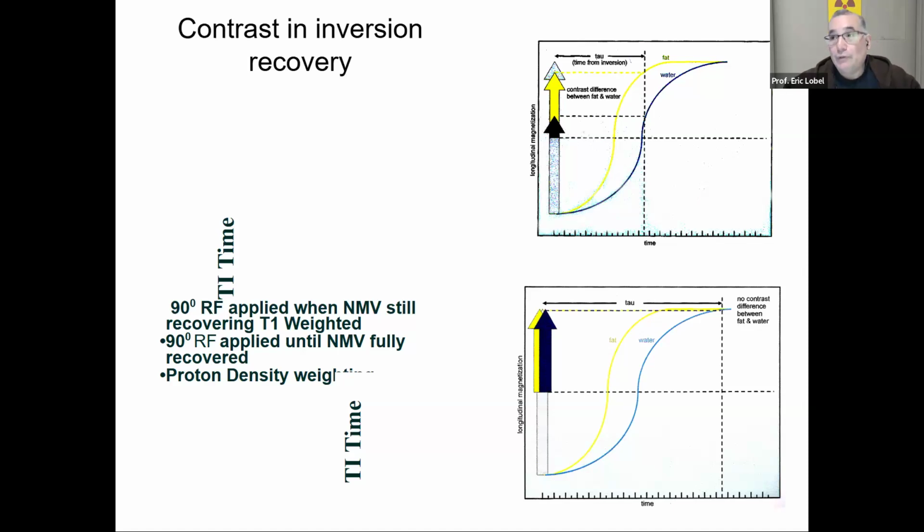And that's exactly what you can do, because the computer, even though the pixel for the bone and the pixel for the blood in the vessel, or the contrast in the vessel, looks almost the same, they both look just as bright, there's a subtle difference numerically that the computer knows that you can't actually see. And you basically tell the computer, if you, in quotes, see bone, turn the pixel off and make it black.